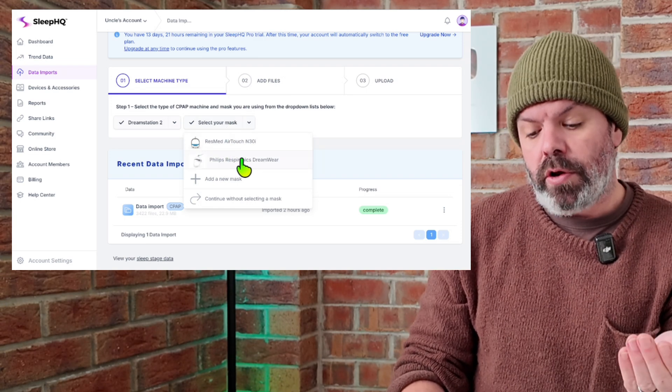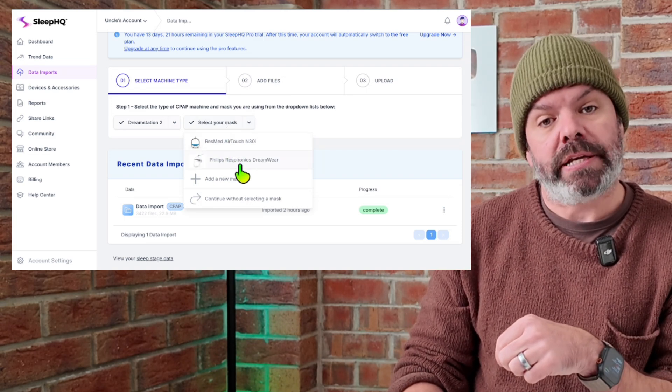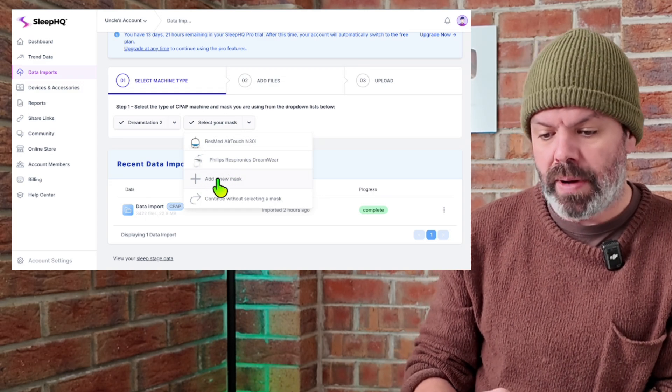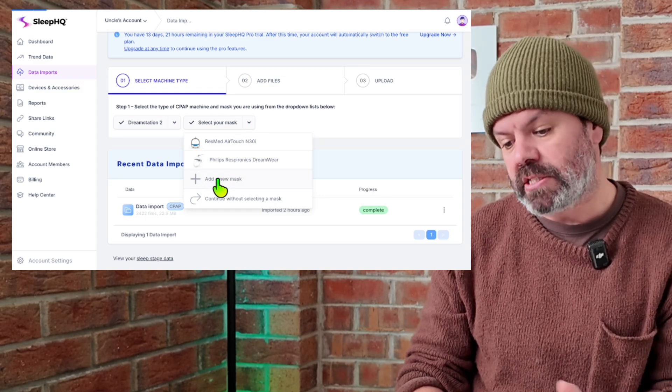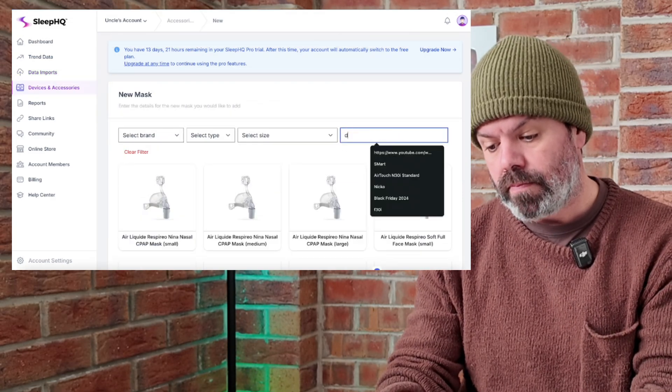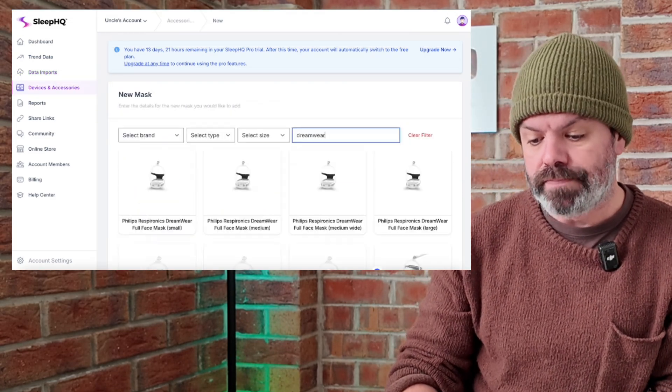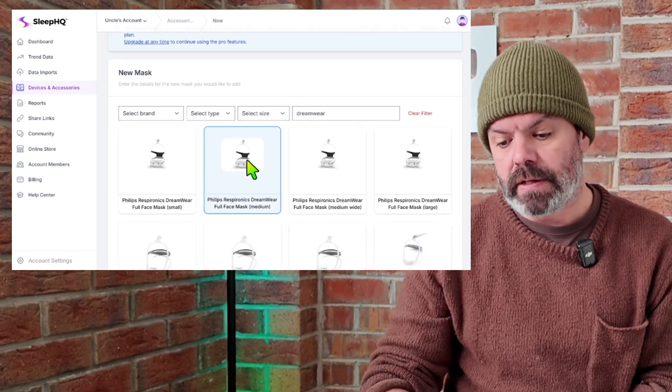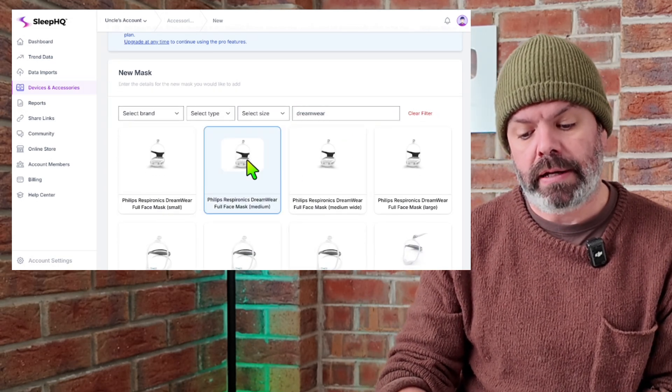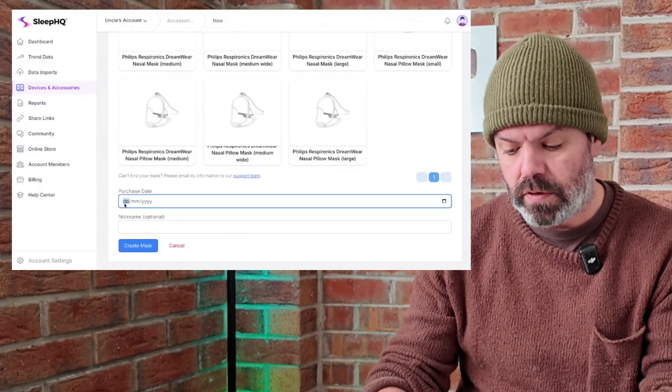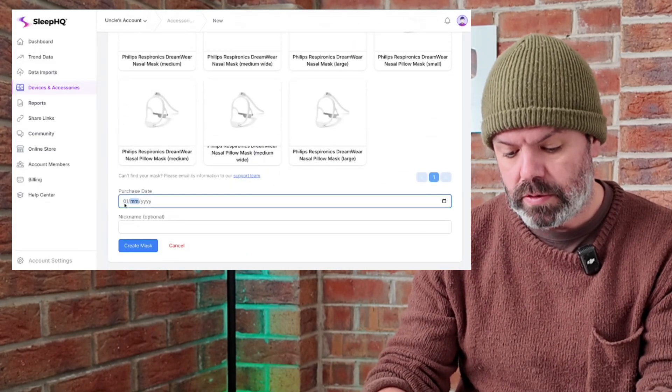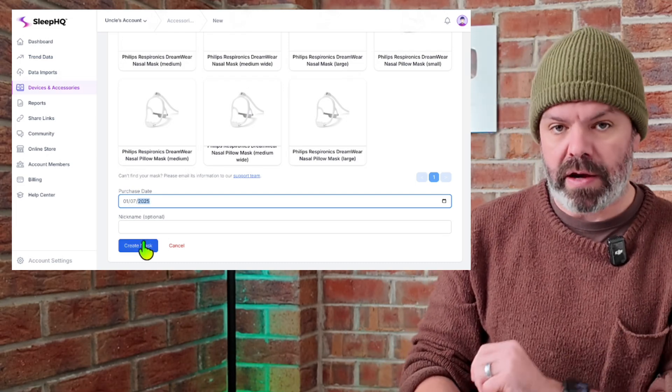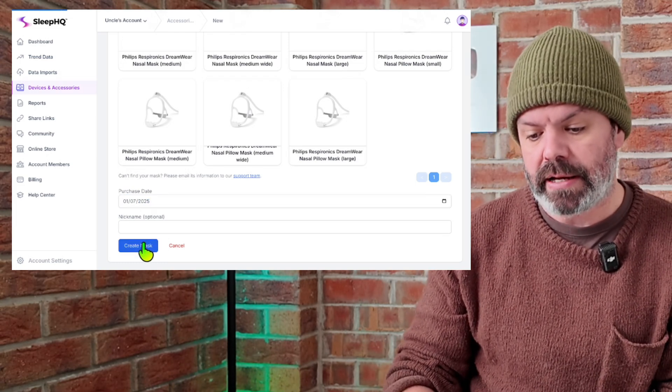If it's your first upload, you'll need to add a new mask here. So you click add new mask. I'll show you it now. Add new mask. And let's just say we're using the DreamWare full. So here's the DreamWare full. I'll just choose medium. And then you scroll down here, choose your purchase date. We'll just go the 1st of the 7th, 2025. Create mask. And now you've added a mask to your profile. It's as easy as that.